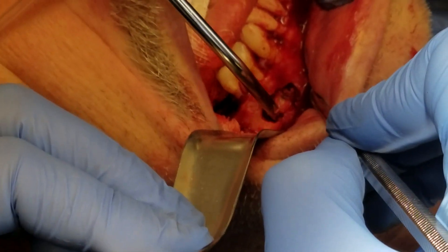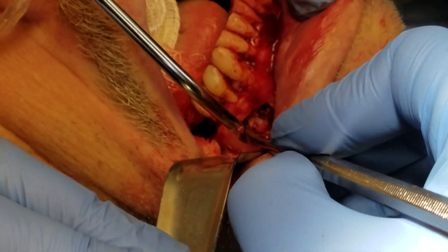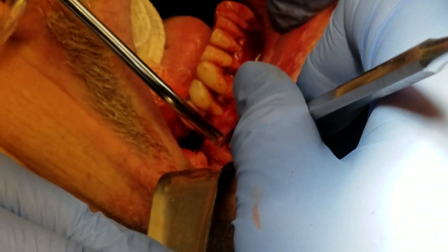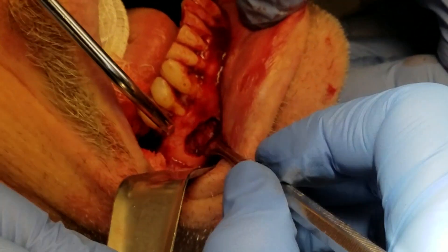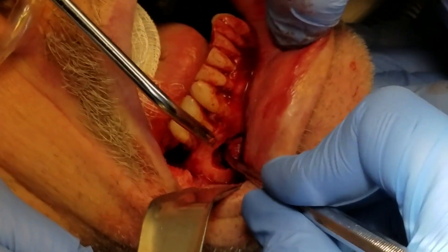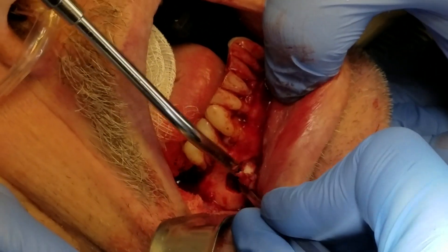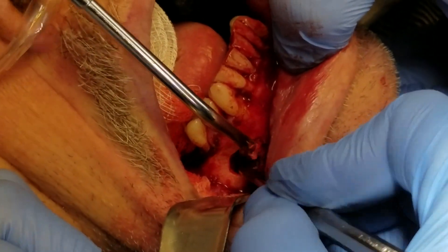So we have this window and the cyst cavity. You can see this white stuff — this is keratin, this cheesy kind of material, and it has a very thin wall. This looks a lot like a keratocystic odontogenic tumor. What I'm going to do now is go around this thing and start to enucleate it and get it mobilized. That's a bunch of keratin coming out of there right now.